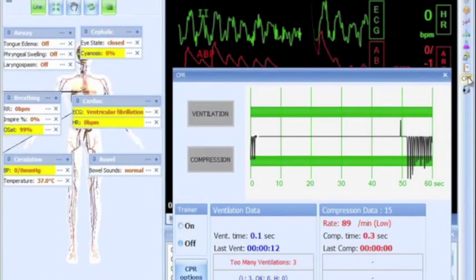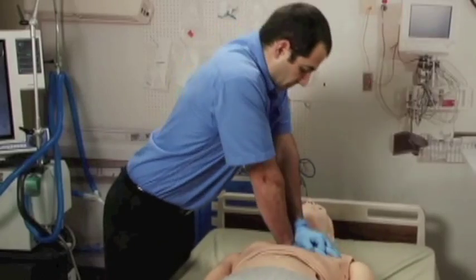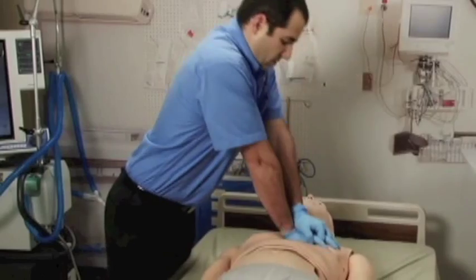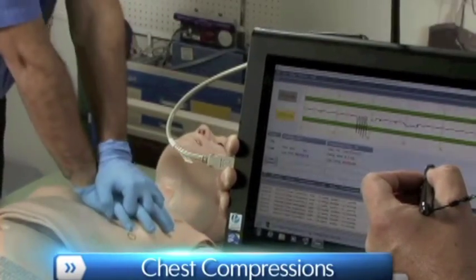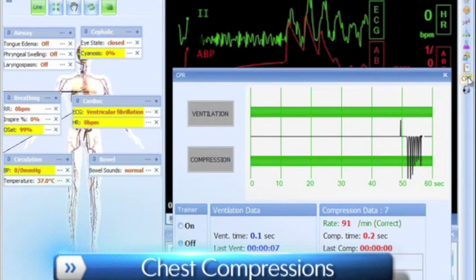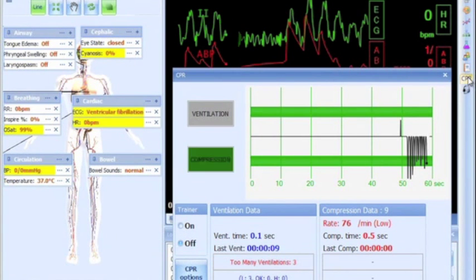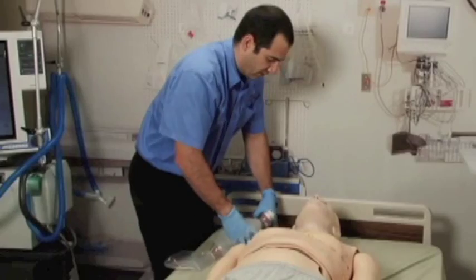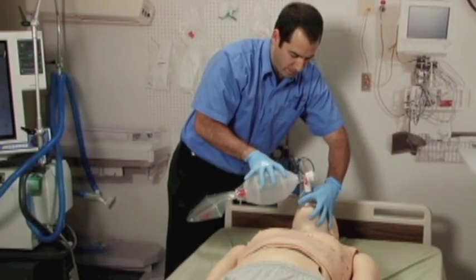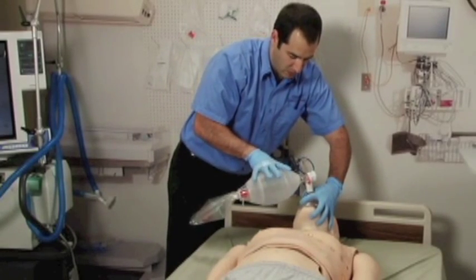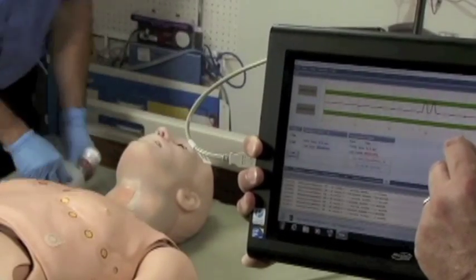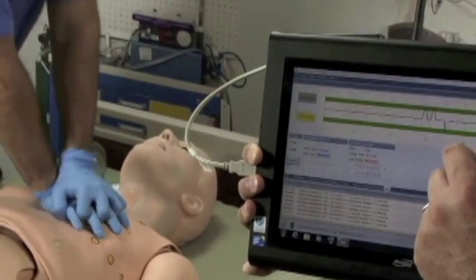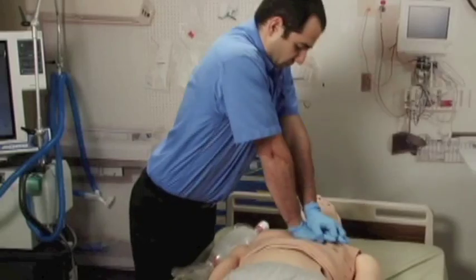Chest compressions are measured and logged, showing the instructor exactly how students are performing. A full CPR sequence can be done with HAL, and providers will automatically be evaluated on different aspects of compressions and ventilations, such as rates, strengths, and ratios.